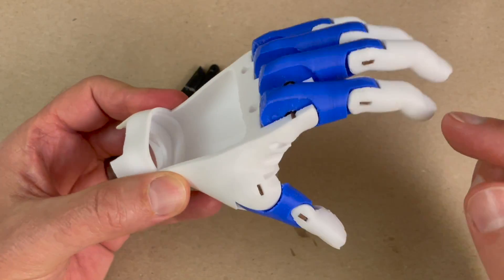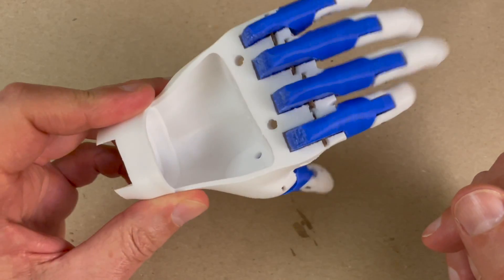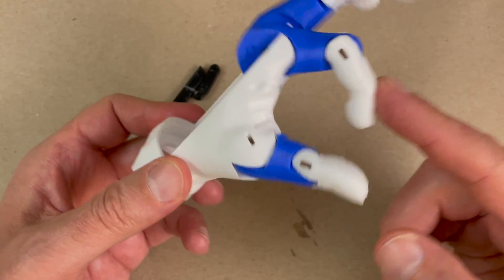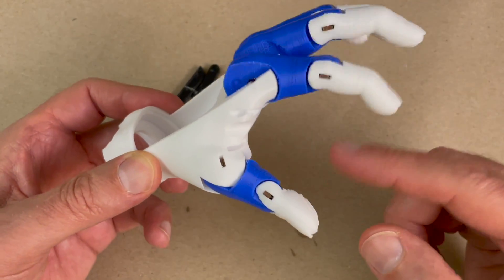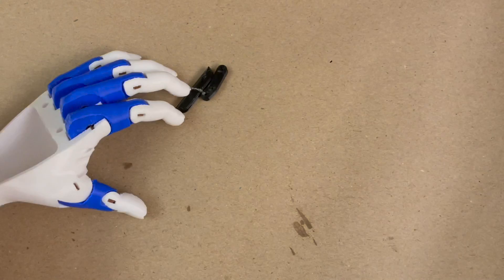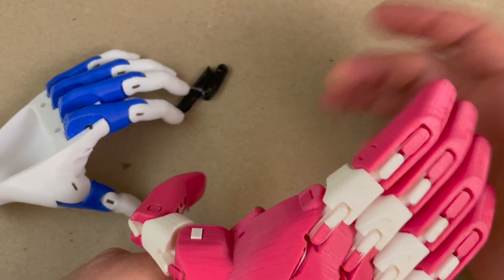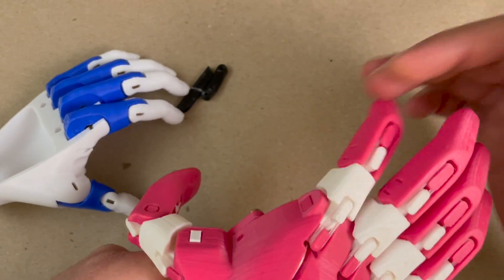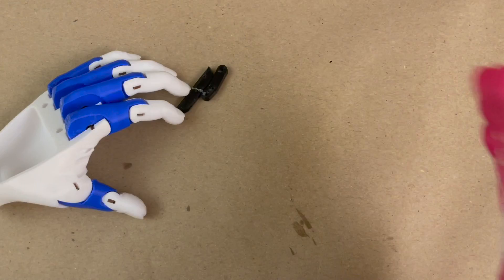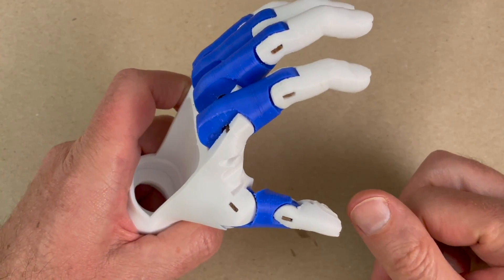Before I do the stringing, I just wanted to make a note about the fingers. By this point, when you're getting ready to string, you want to make sure that these fingers are really easy to bend. These should bend and snap back really easy. I have here an older Phoenix, and it should be easier to bend than these. These bend fine, but these should be easier and bounce about the same.